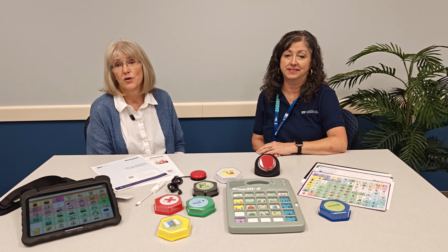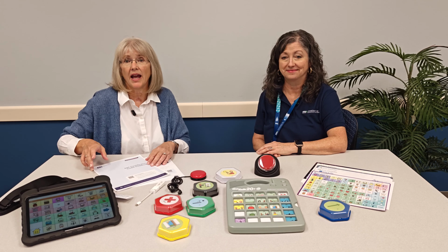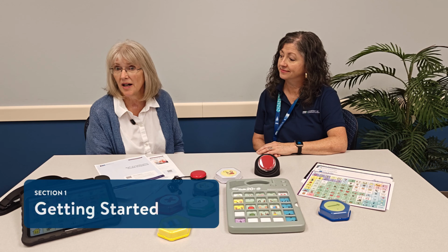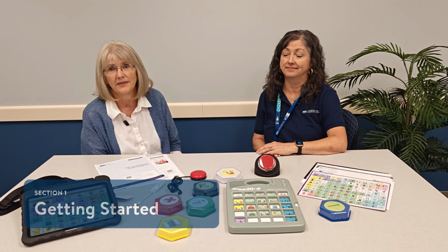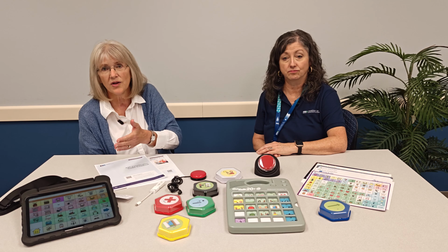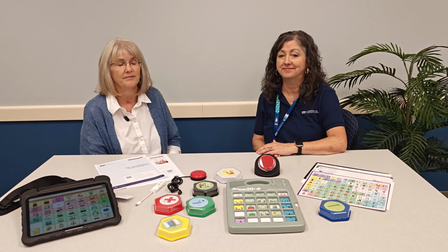When you first receive the toolkit, you'll start by unpacking the equipment and reviewing the AAC device guide included in the guidebook. Section 1 introduces you to 3 types of AAC tools you'll be working with: non-electronic, light-tech electronic, and high-tech electronic devices. The guide also provides links to short videos and instructions on how to operate each of the tools, so you get familiar with them before you get started using them.